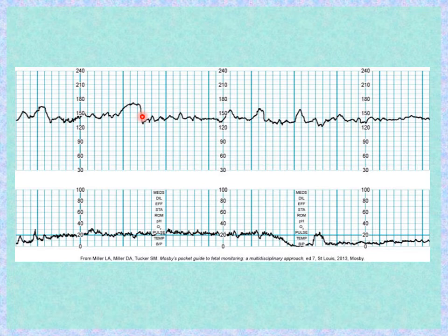An acceleration of the fetal heart rate lasting longer than 10 minutes above the baseline is no longer considered an acceleration, but a change in a baseline heart rate. Accelerations can be either periodic or episodic. They may occur in association with fetal movement or spontaneously. Accelerations can be stimulated through vibroacoustic stimulation or fetal scalp stimulation. Accelerations are considered a sign of fetal well-being and an intact neurological system.